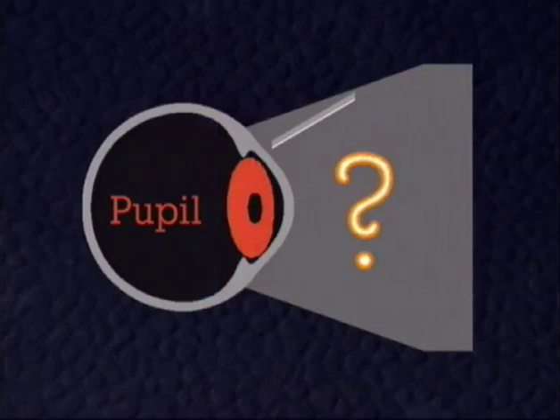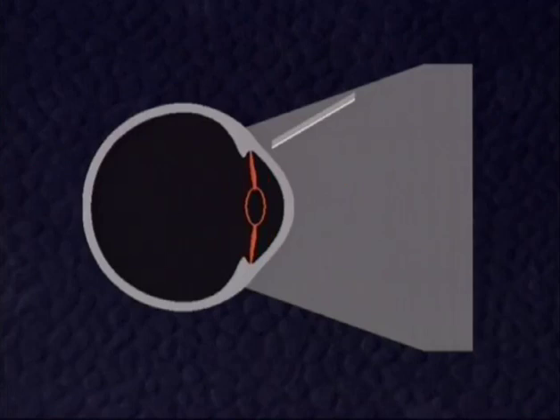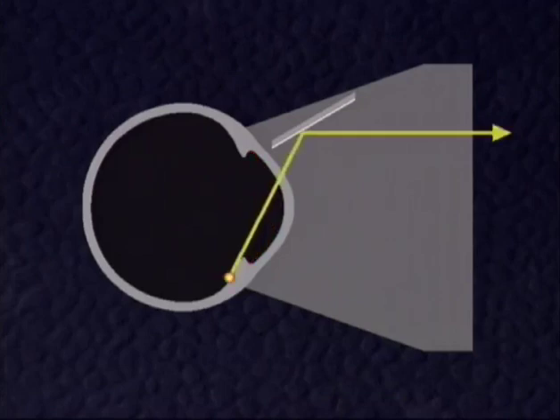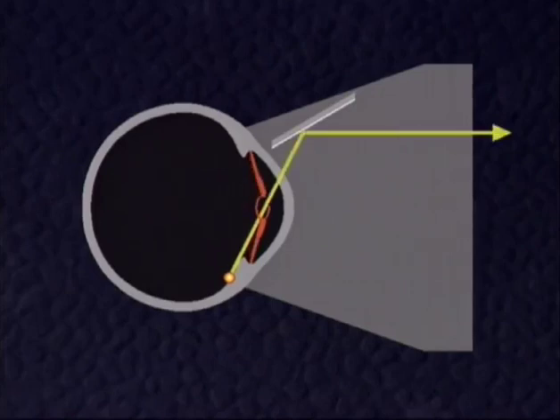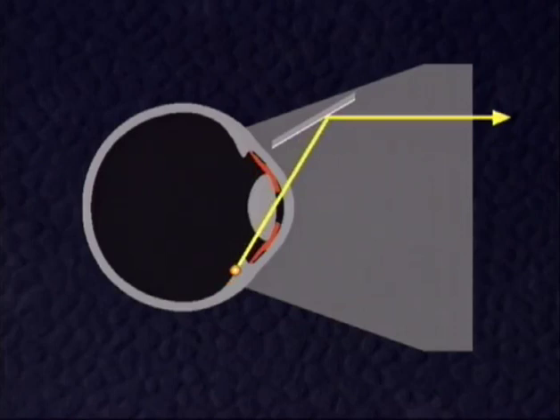And what is the role of the pupil? Actually, whether the pupil does or does not obstruct the view on the periphery depends on its position, either posterior or anterior. This diagram shows a ray from the fundus periphery and how the pupil interferes. A pupil which is far posterior must be wide in order not to obstruct the view on the periphery. A narrow pupil is an obstacle unless it is in an anterior position. Therefore, in an eye in which the lens has pushed the iris forward, even a narrow pupil permits a view of the peripheral fundus.